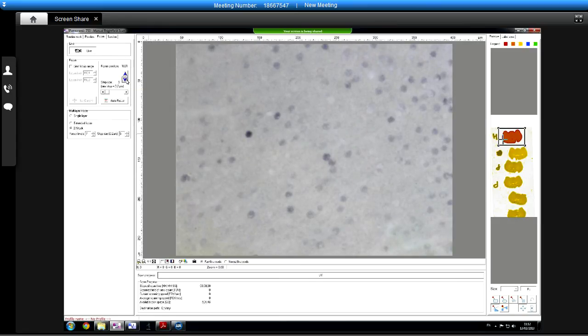So when you capture them manually using those steps, have you done that just on a single microscope? Have you done those stacks there? No, okay, I just wondered how you did it. Okay, so let's get it to do 7 at a micron apart, about the middle point of where it thinks the focus is. Let's just have a look at them all. I'll just leave that going now, and then we can have a look at that later on.